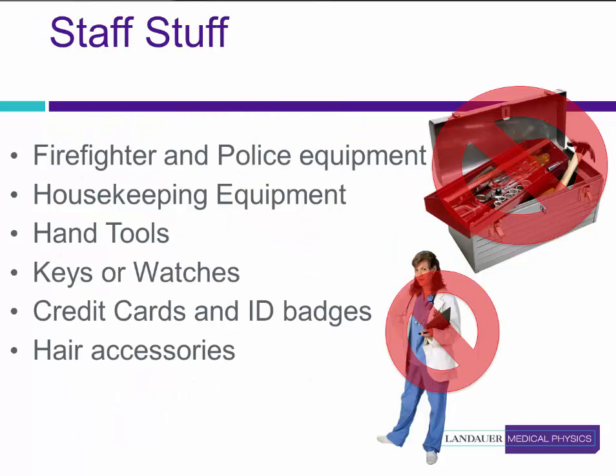In order to determine whether something should be brought or worn to the MRI suite area, it's recommended to be reviewed with the MRI staff technologists. But the following lists give you some indications on what should and shouldn't be brought into the MRI zones, which we'll discuss later. Nearly all firefighter and police equipment, general housekeeping equipment, regular hand tools, keys, watches, credit cards, ID badges, and hair clips should be removed before entering the MRI suite area.